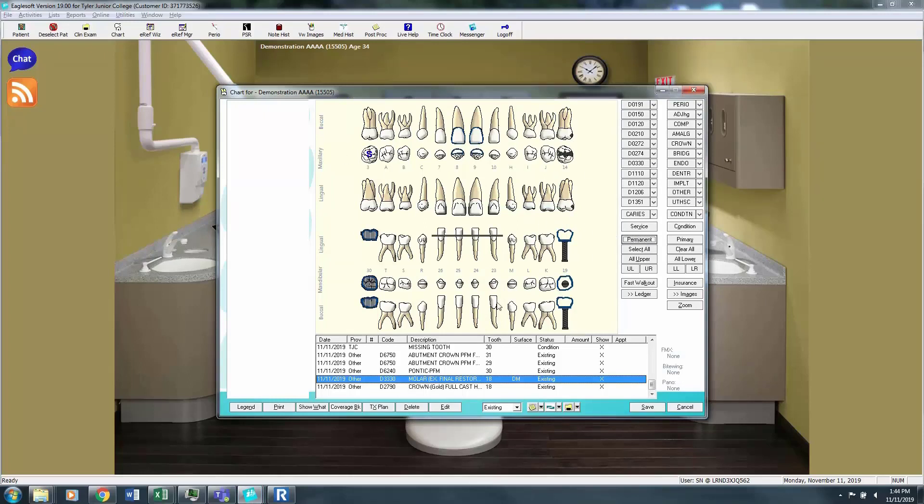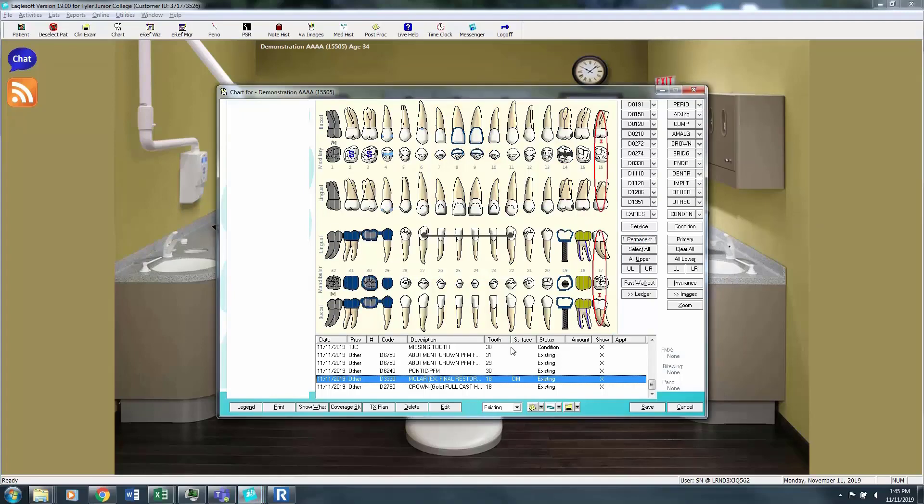Now you'll notice the treatment I had in the previous chart still showed up. In a new patient mixed dentition, they would not have any treatment. So I'm going to select all and change them all back to permanent. And my dental chart is still there. Hope this was helpful.